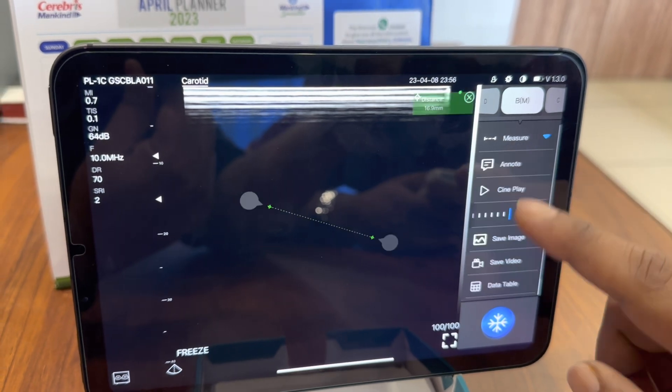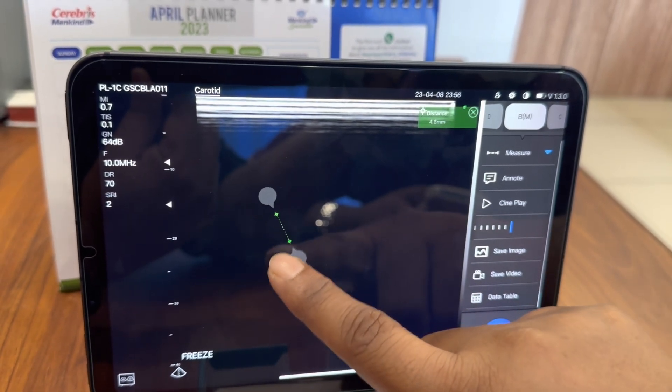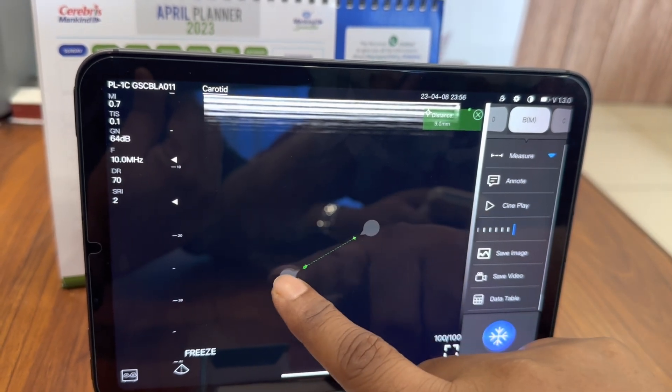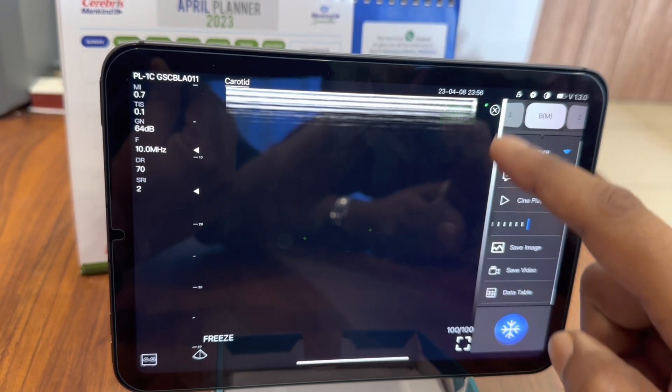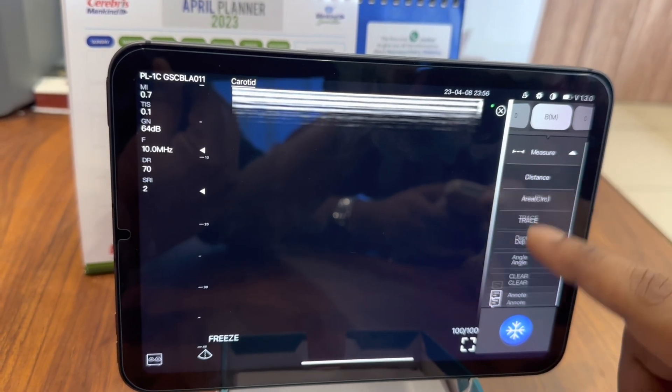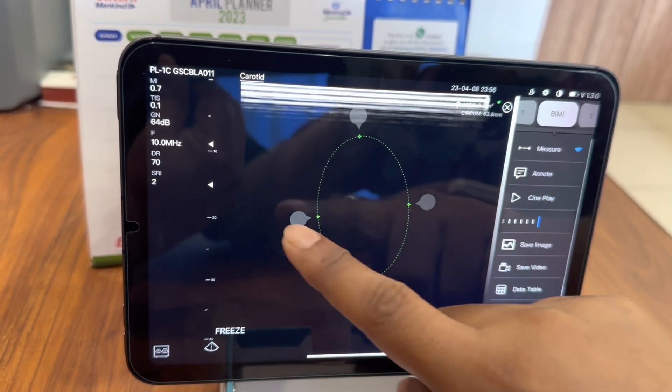By clicking the measure button you can see that a lot of calculations can be made. You can find the distance, the area, trace an object, find the depth from skin, and find the angle between two things.